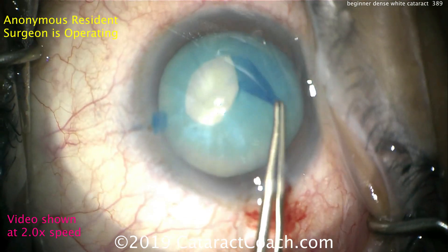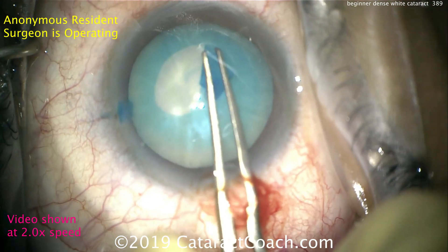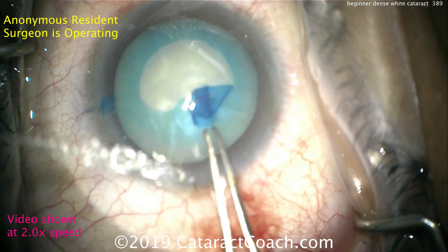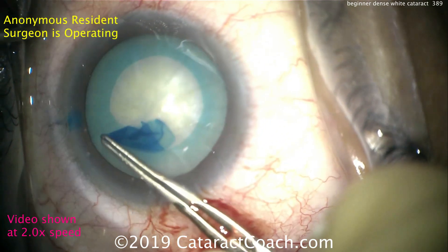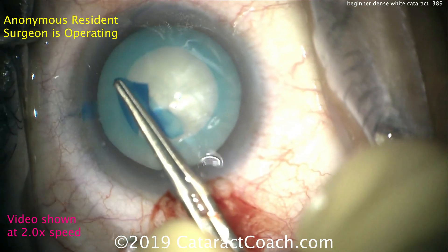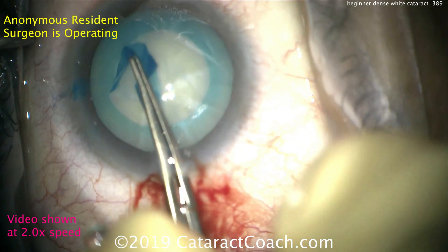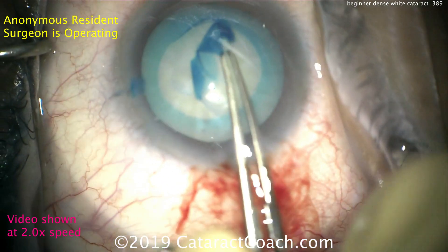We're going to show the entire video at two times speed, just so we can be efficient. This capsule has been stained with TriPan Blue dye. We're achieving a nice capsulorrhexis here. This is not an intumescent lens, so there's not any milky fluid coming out. You've seen our videos before of how to decompress that capsule bag and express the lens cortical liquid in order to prevent Argentinian flag sign. That looks like a pretty nice rexis.